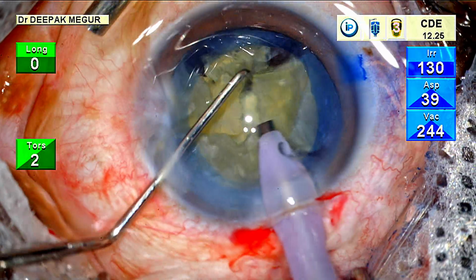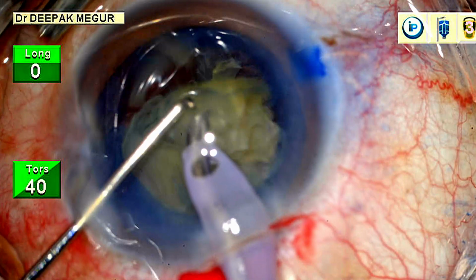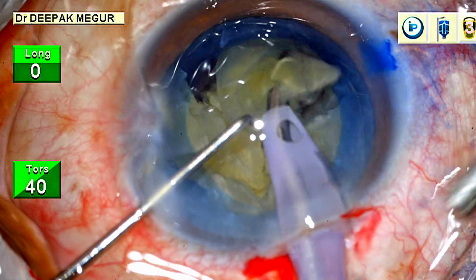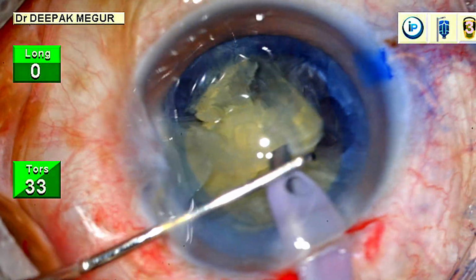The chopping maneuver was usual, but I can't thank my stars enough. With such a large PC tear, the nucleus still didn't drop, not even a fragment. As the saying goes, it is sometimes better to be lucky than good. So on a serious note, why did the nucleus not drop in this case?